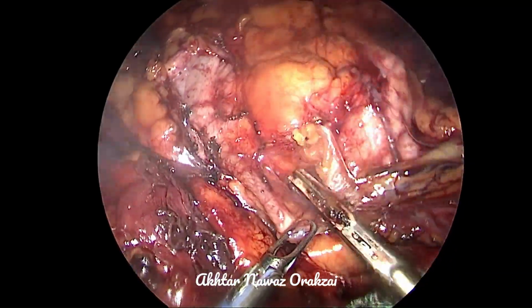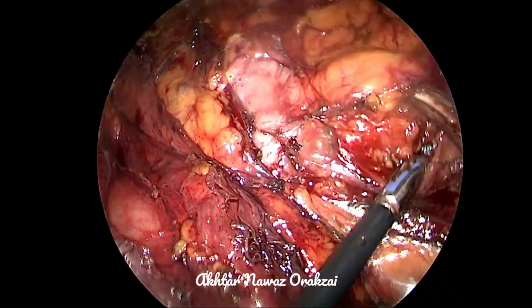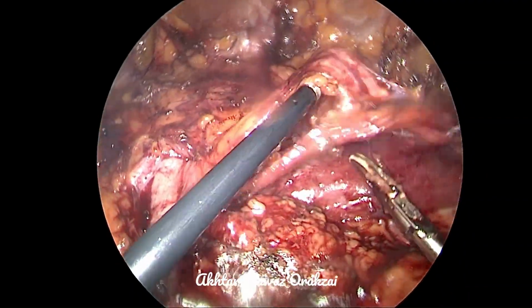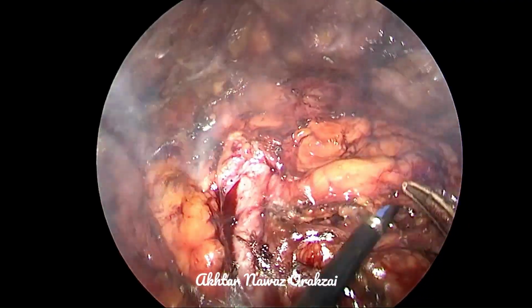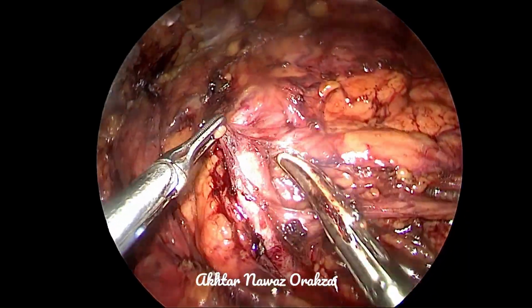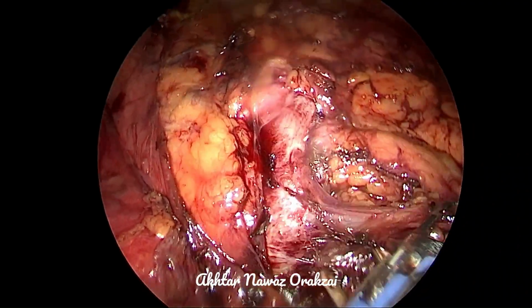As I already mentioned previously, the anatomy of the vascular system is such that the artery is usually found in the posterior inferior aspect of the renal vein. In order to reach the renal artery, it is at times needed to dissect, clip and then divide the gonadal vein. This makes the approach to the renal artery very easy.